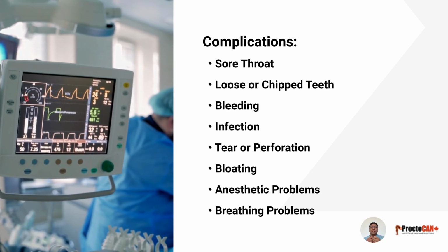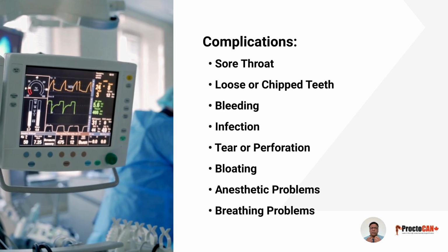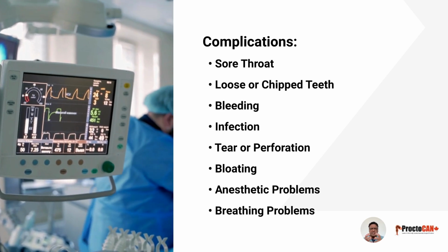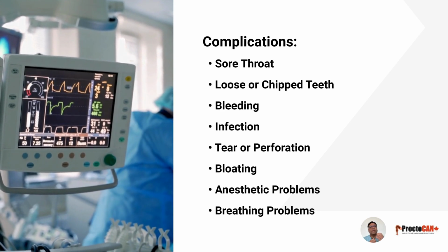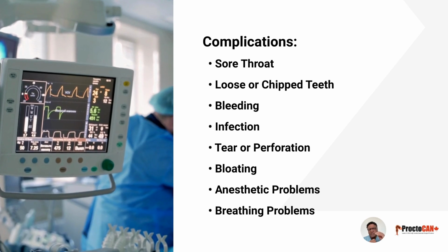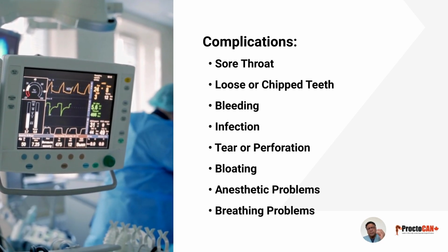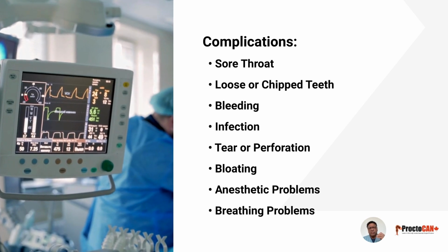It is important that you do not eat anything for at least 12 hours before the procedure to reduce the risk of anesthetic complications, especially breathing problems. Intravenous complications can also occur, which may include swelling, inflammation, bruising, blood clot, and infection. If you experience severe pain or unusual symptoms after the procedure, please contact us immediately or seek emergency care.